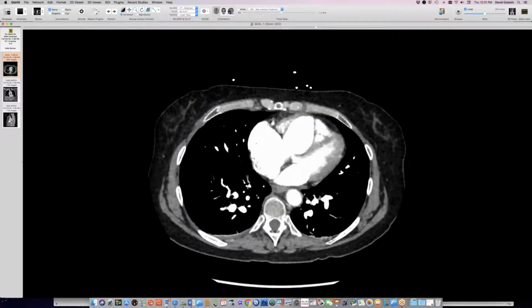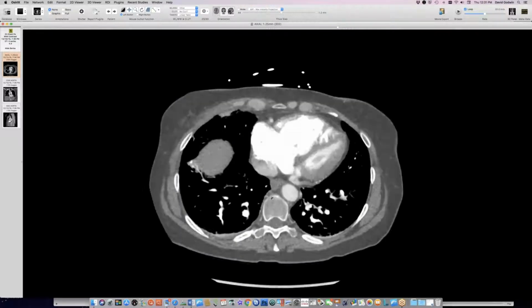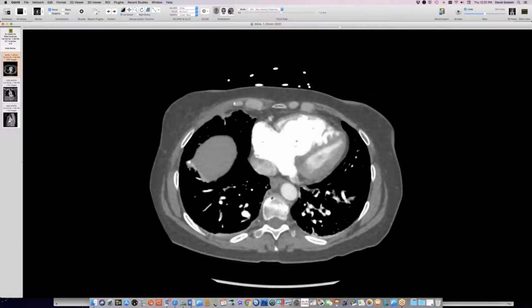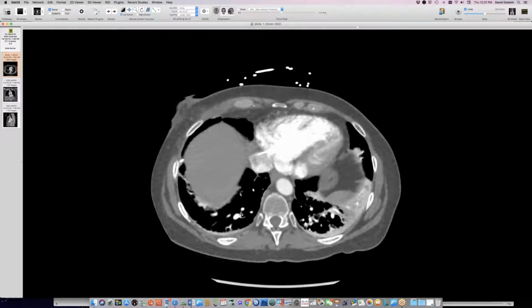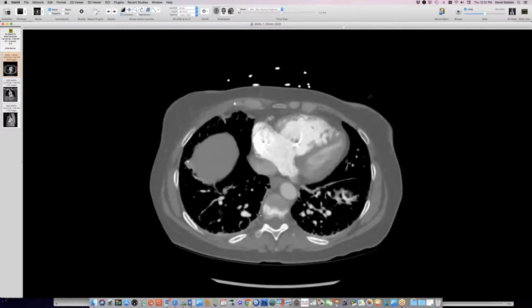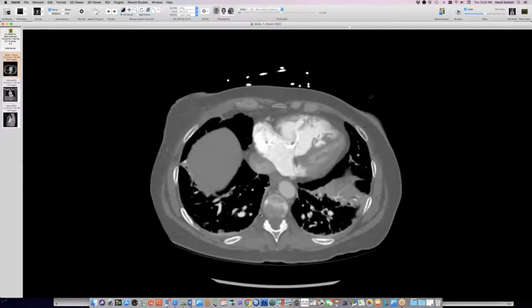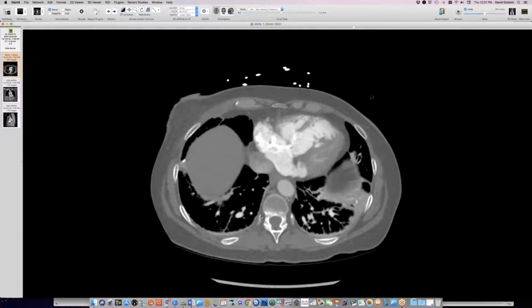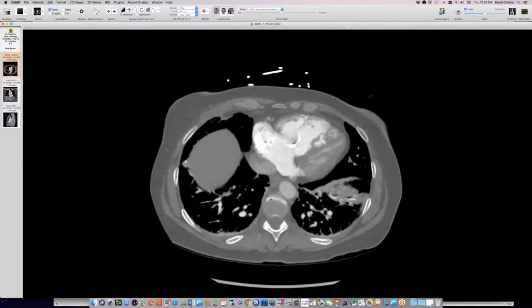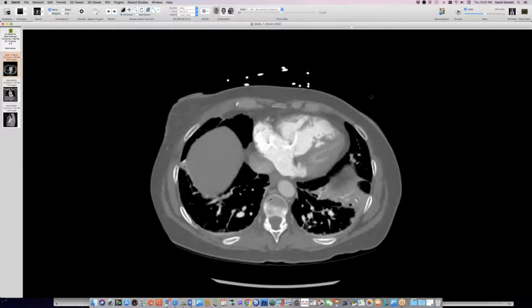So this person had a PE study, and there's an incidental finding that I want to ask you guys about. I wish that Seth were here to help me with this, but Matt Cham, our new radiologist, has joined us. Well, Matt, do you want to describe what we're seeing here? Oh, I'm sorry. Seth is here. Okay, I'm glad you're here.